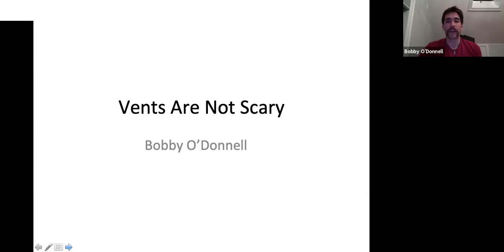So if we can pull these reports and I can have some data that shows when our paramedics are showing up at the facility, they're needing to ask for different sedation, or they're needing to ask for a pain management option, or they're needing to ask for different vent settings, this is all stuff that we can pull together.